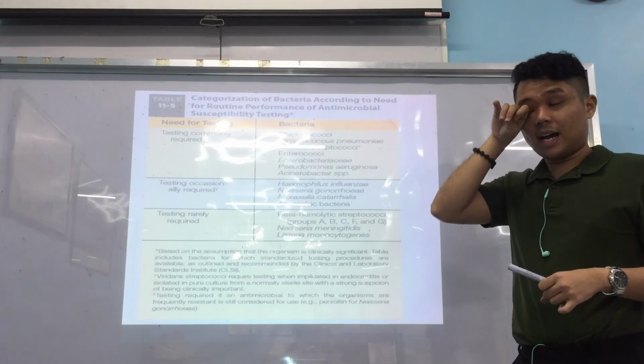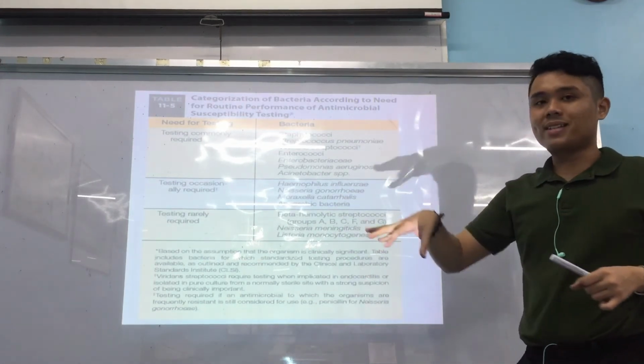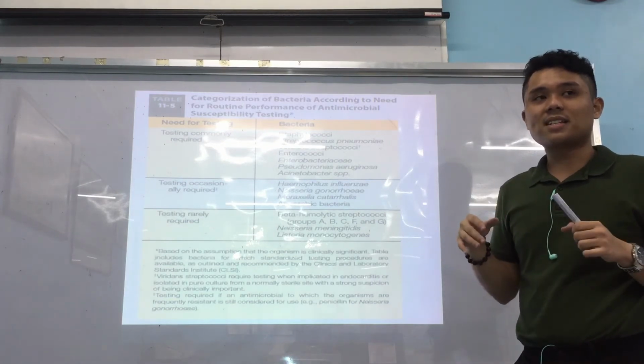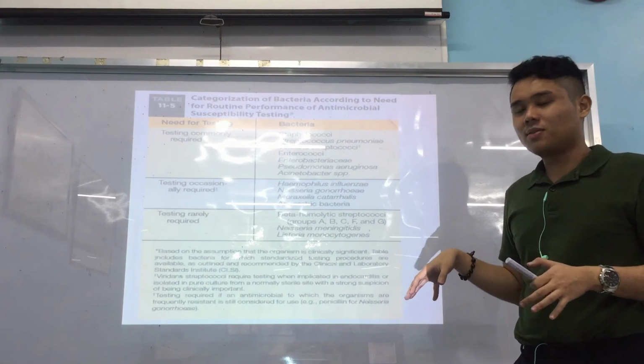All right. So mga in cases lang na example Neisseria gonorrhoeae, di ba? Penicillin ato ang tambal for that. But there are cases na naanay mga resistant to penicillin. So in ana ato siyang i-test for AST.